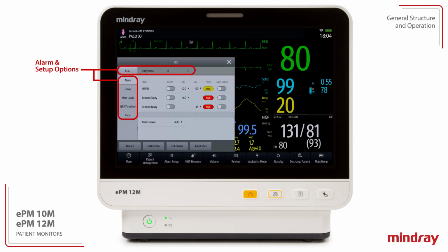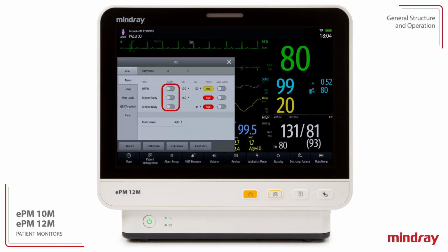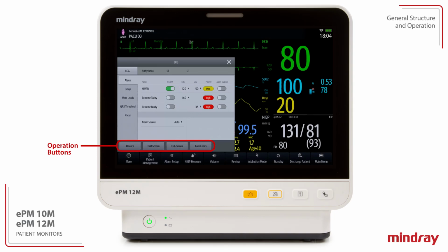Tabs along the side and top of the dialog are used to select alarm and setup options. Some dialogs have additional tabs for access to other items and options within the main body area. Switches are included in each parameter dialog to turn functions on or off. The switch is green when the function is on. Operation buttons are located at the bottom of the dialog.